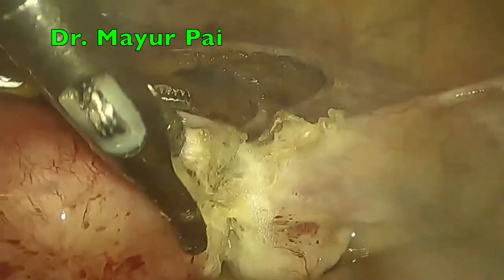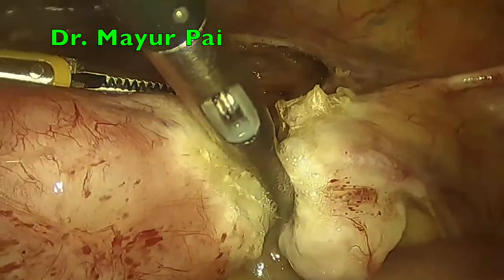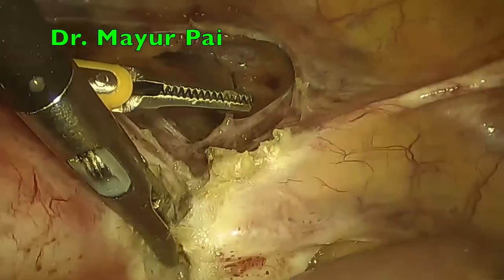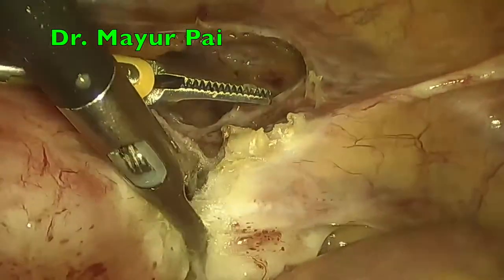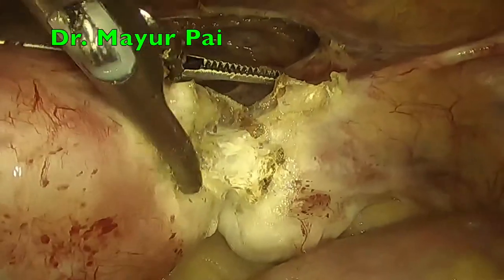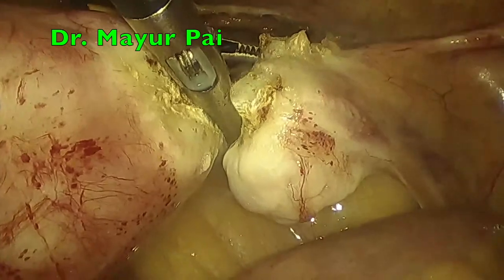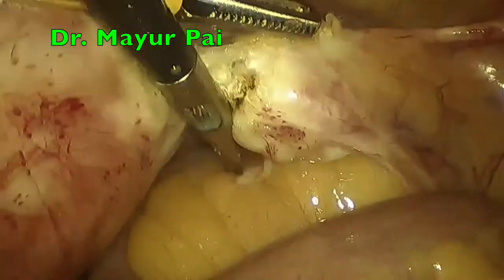However, with the use of our laparoscopic shearer, we can give a quick burst of coagulation followed by cutting. As you can see, there is hardly any ligament to hold. However, since these instruments are very thin, they do an amazing job.